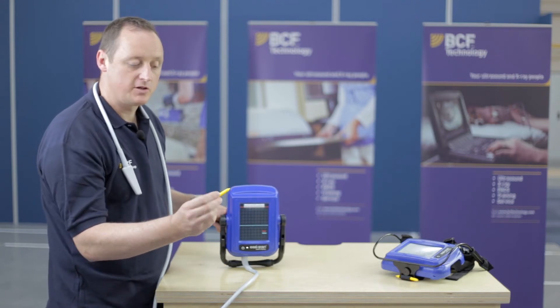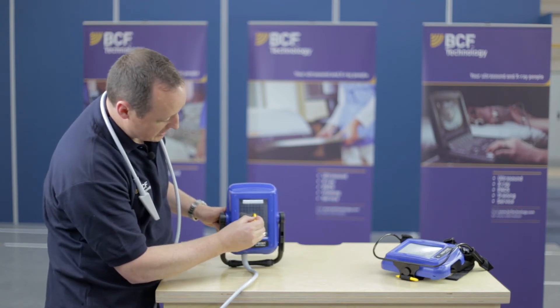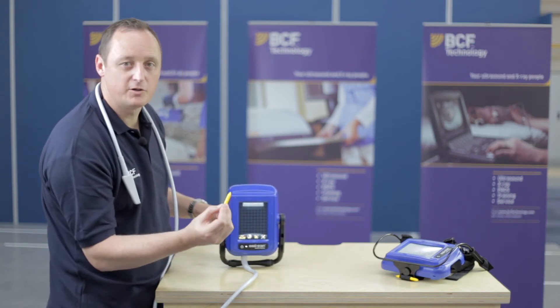To assist your back fat operation, we have a stylus. As it is a touch screen, you can use the stylus to adjust where it is that you'd actually like to make your adjustments.